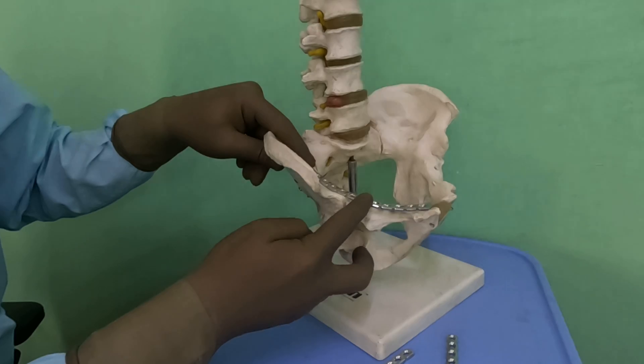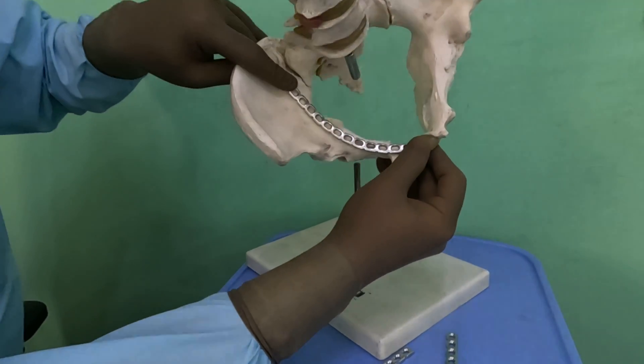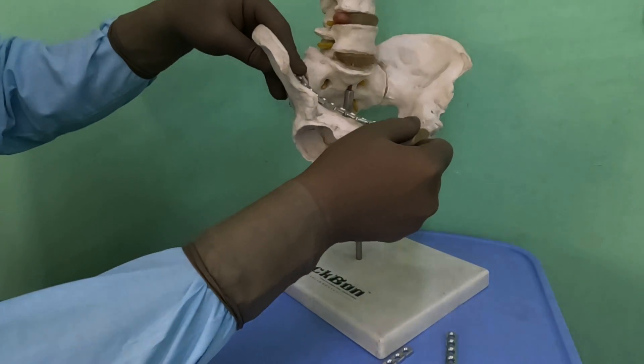This is the demonstration for contouring of the anterior pelvic plate, which is a very common plate for acetabular fracture fixation.